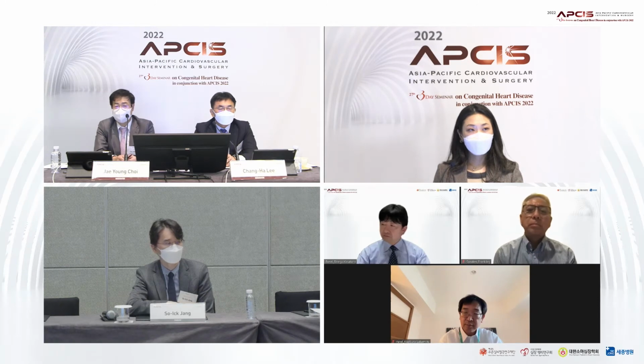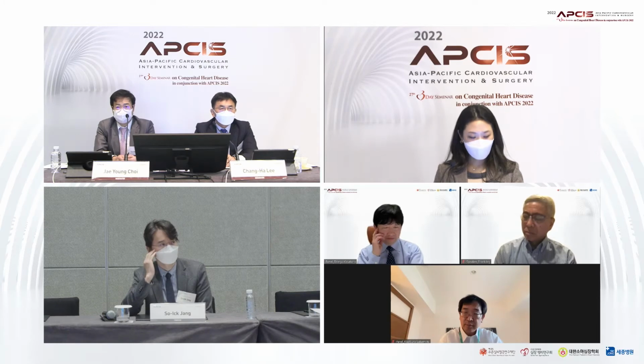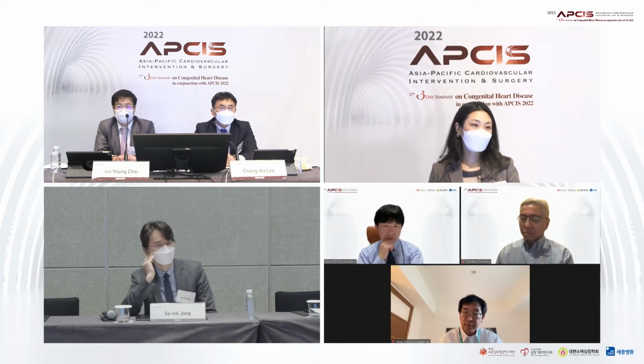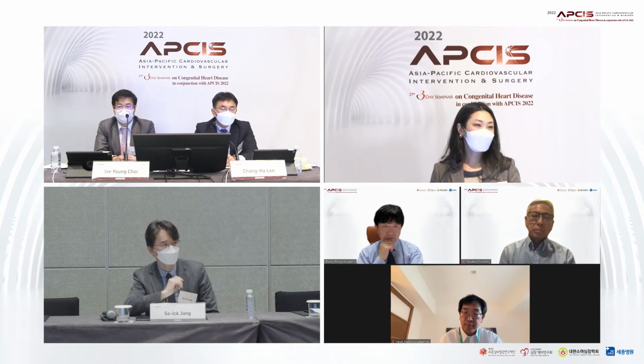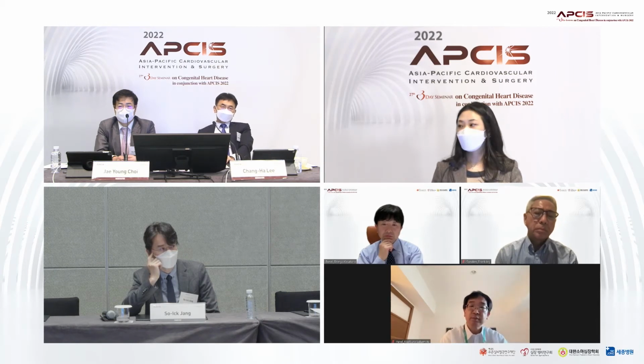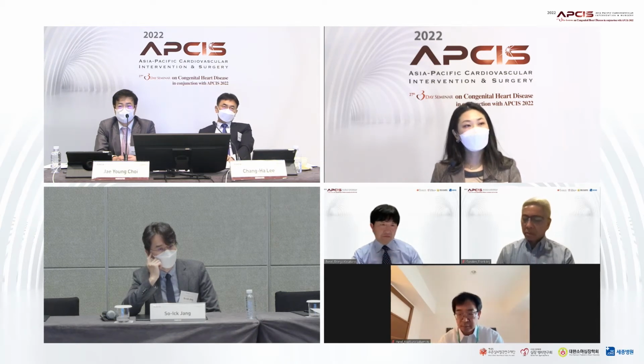Well, again, it depends on your surgeon. You need to tell them frankly what will happen. But for me, if we put a PDA stent in initially, it may take redilating it maybe one or two times down the road before completion of the repair. With that, if the surgeon is okay, we will go for stenting. But if the surgeon says, I don't want to take the stent out in the future, then let them decide. But one thing I would like to share.